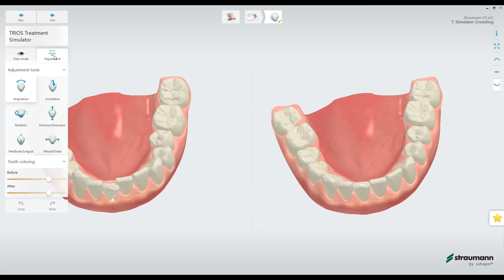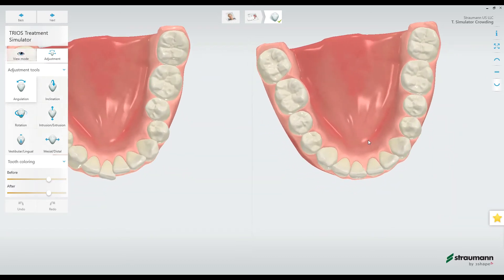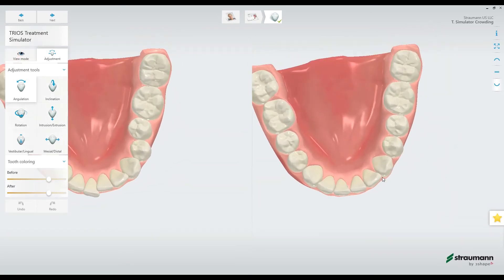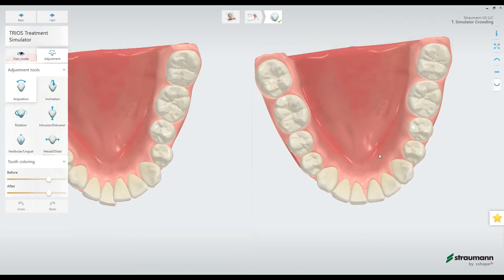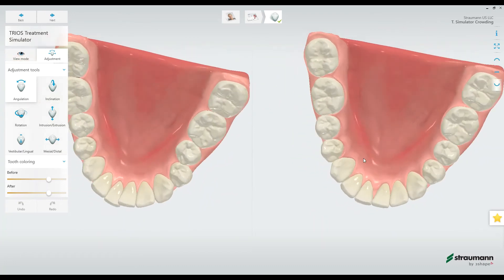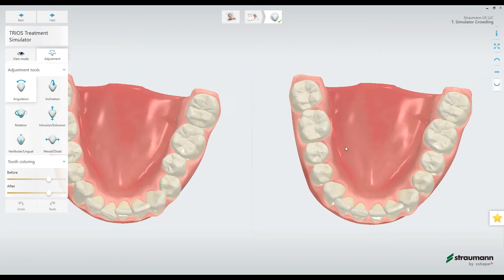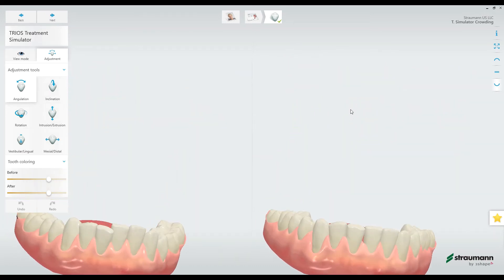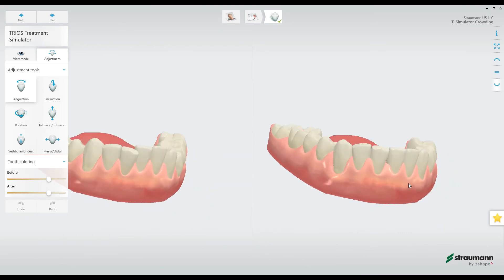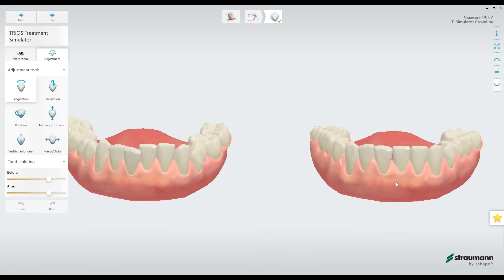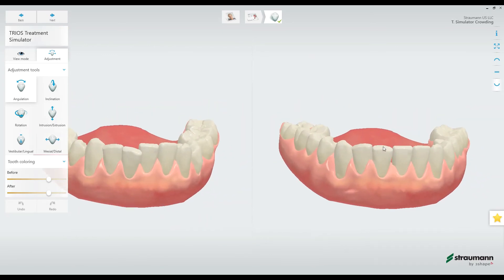Over here I have the adjustment option. The adjustment allows me to make fine-tuned adjustments to the treatment outcome, or the proposed outcome. It's important to note that this is just a demonstration showing what's possible to the patient with an idealized ortho treatment — this is not necessarily indicative of their final treatment outcome.